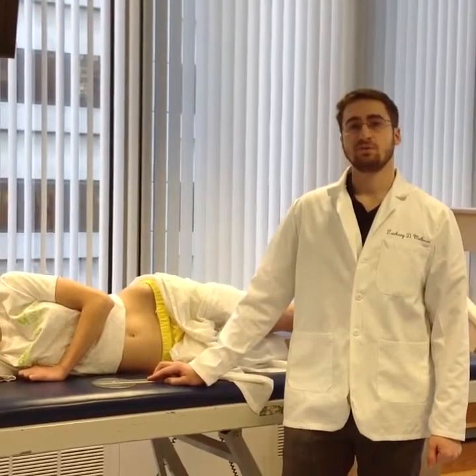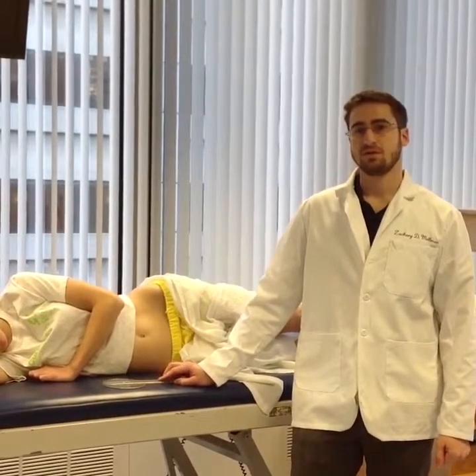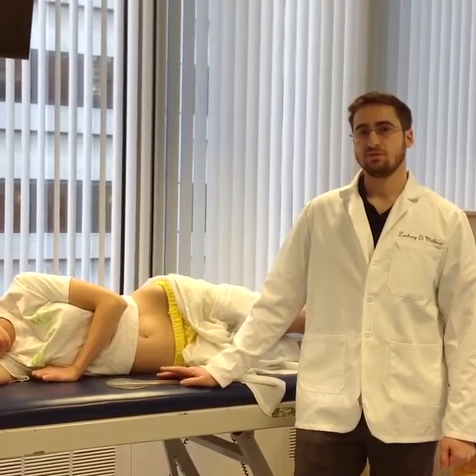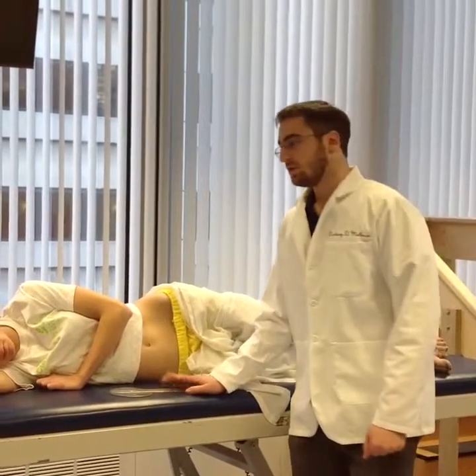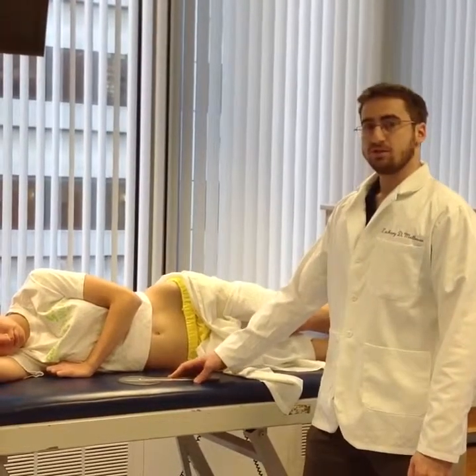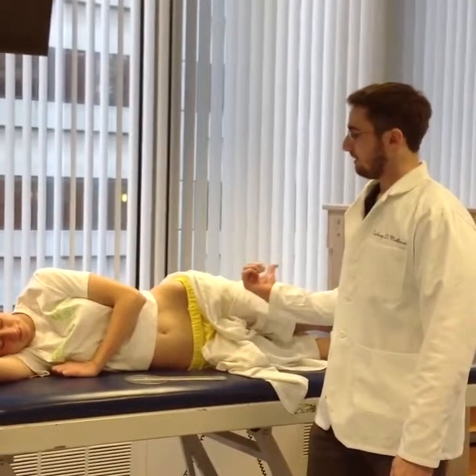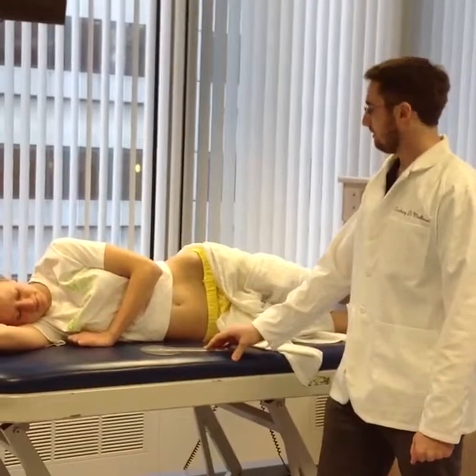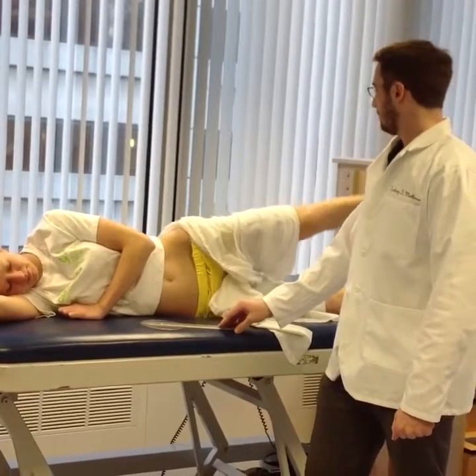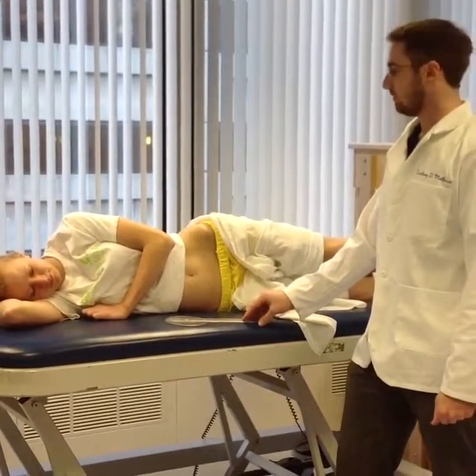We're going to start with active range of motion of hip abduction using the goniometer. As you can see, we have our patient here in sidelying. The big cue for the patient is to raise their foot to the ceiling — and we're just going to demonstrate first. So that's exactly the motion for hip abduction we're looking for.